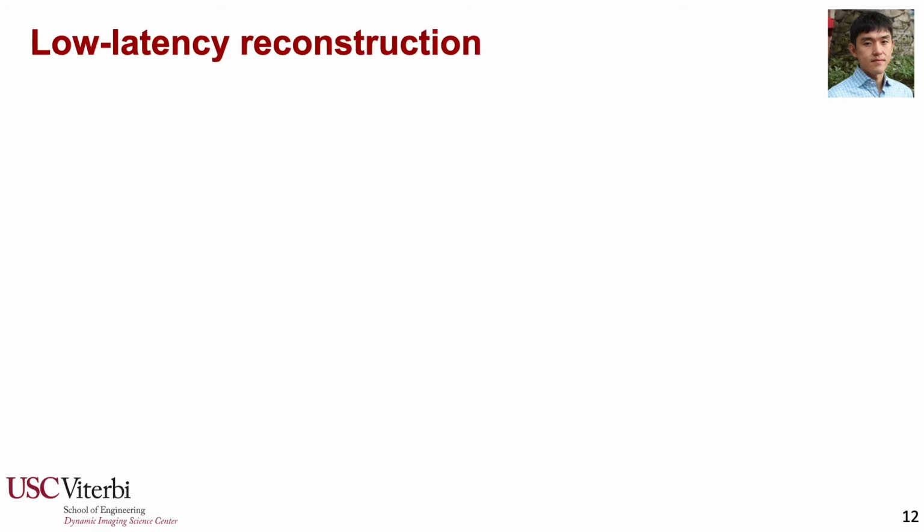So I have talked about a lot of the amazing techniques made available by the high-performance low-field systems, but there are also quite a lot of unmet needs and challenges in terms of doing real-time MRI. A very unique requirement is the ability to do low-latency reconstruction. This is very important for some specific studies, such as speech or cardiac intervention.